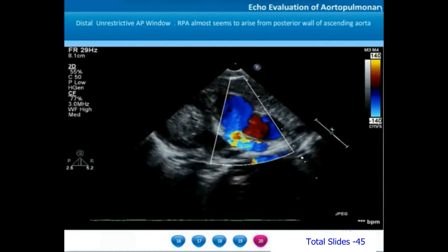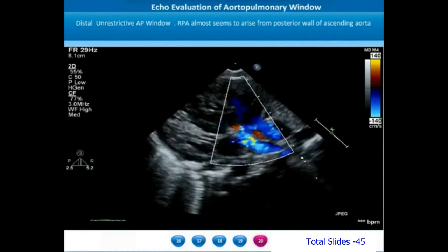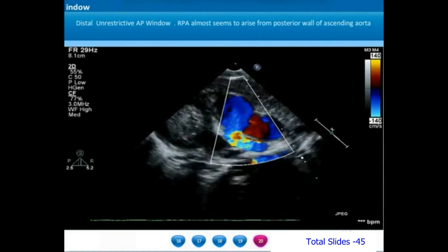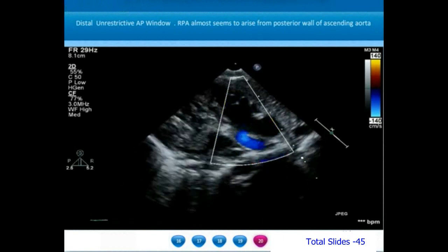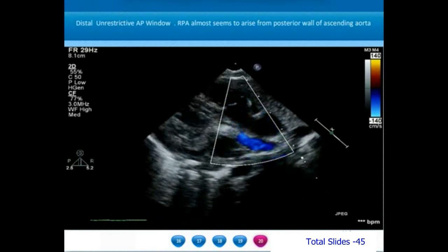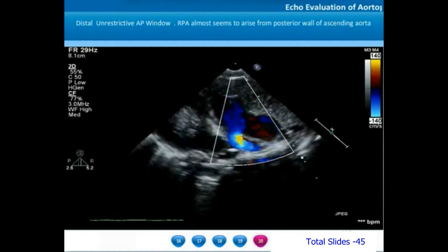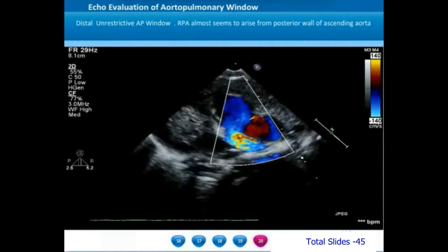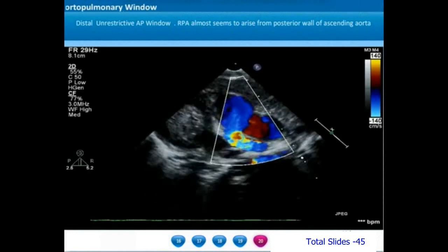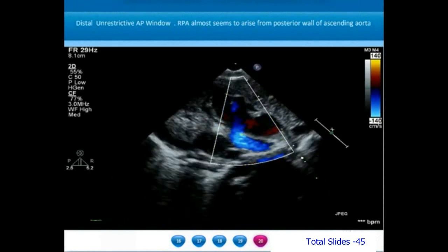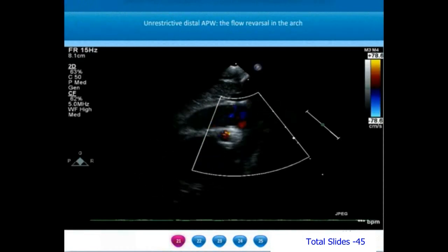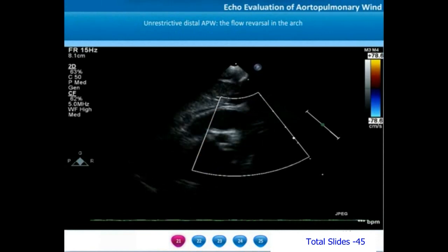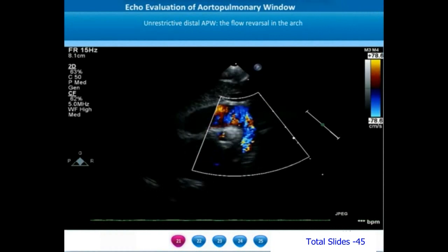On a modified parasternal long axis view, we notice the main pulmonary artery anteriorly and the right pulmonary artery almost originating from the posterior wall of the ascending aorta, with a very large distal AP window. The high-velocity blue color flow is seen in the right pulmonary artery, which is seen to arise from the posterior wall of the ascending aorta. When we interrogate color flow in the aortic arch, we notice in diastole a brief red flow — an indicator of diastolic flow reversal.